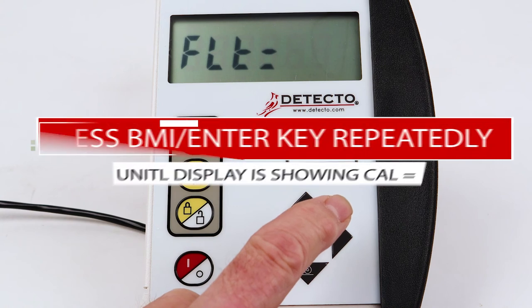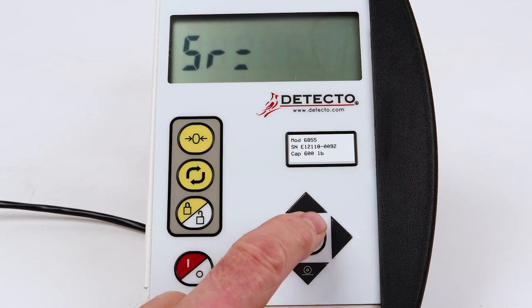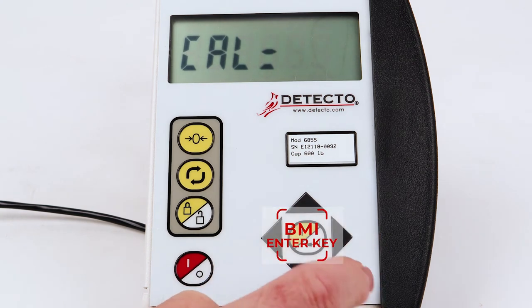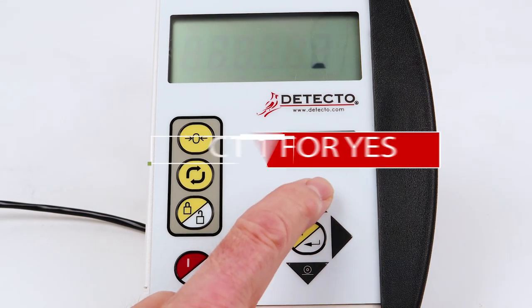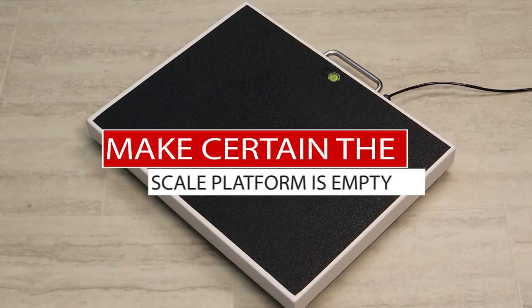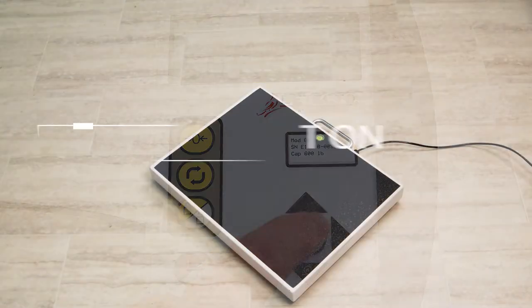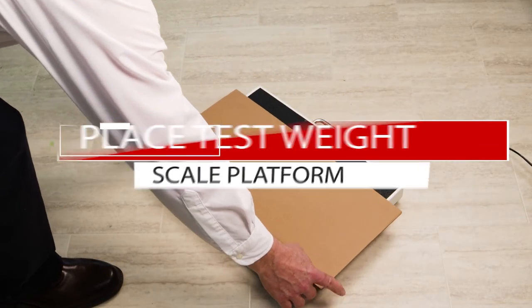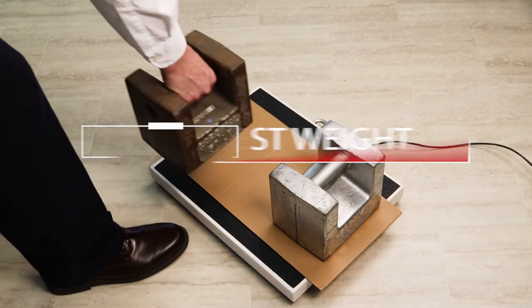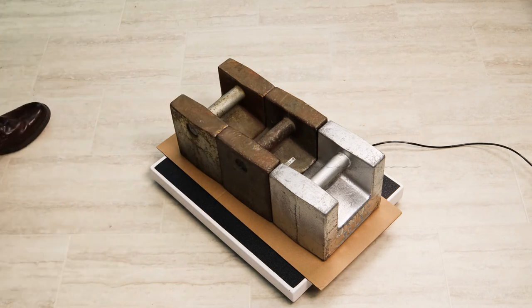Press the BMI Enter key repeatedly until the display is showing C-A-L equal for the calibration setting. Press the up arrow key to select 1 for yes and press the BMI Enter key. Make certain the scale platform is empty. With the display showing LOAD equal for load calibration weight, place your test weight on the scale platform and press the BMI Enter key. You should use a minimum of 50% of the scale's capacity; however, 70% to 100% is recommended. Refer to the capacity label or serial number tag for the capacity of your scale.